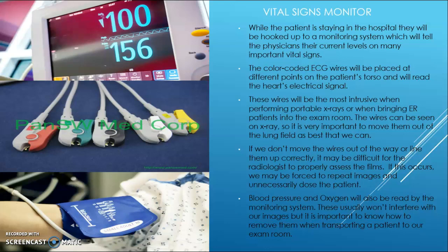If we don't move the wires, and they show up in the lung field, it may be difficult for the radiologist to properly assess the films. If this happens, we may be forced to take repeat images. We'll dose the patient again for no reason.